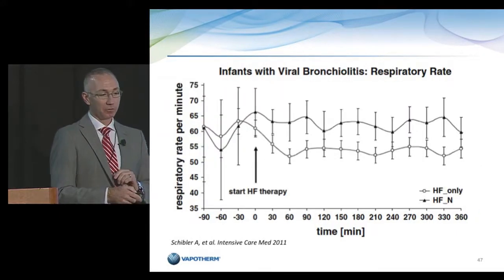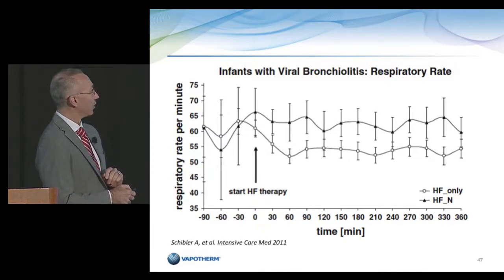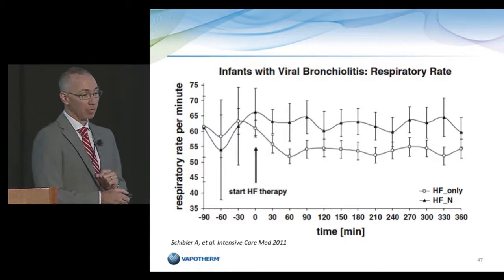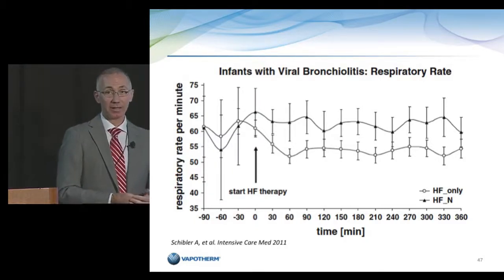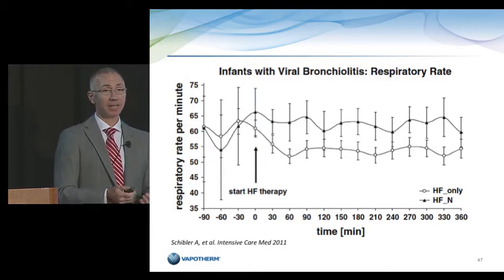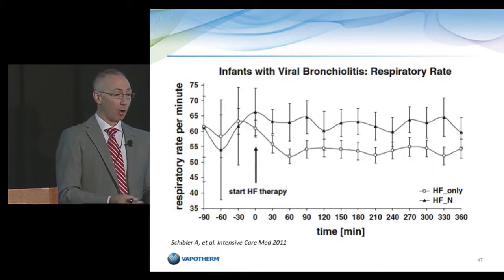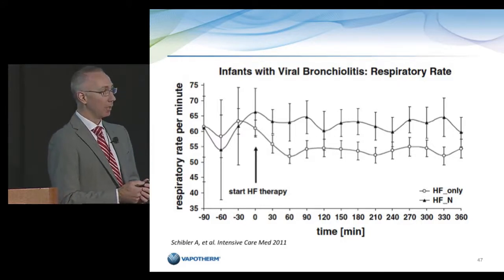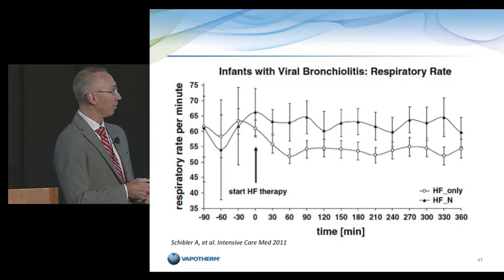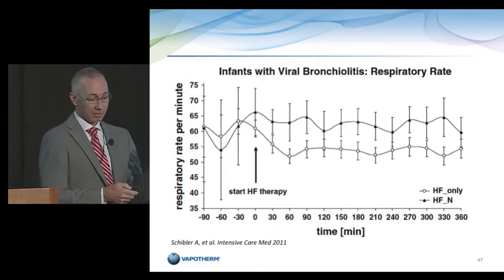The same is true for respiratory rate. So by 30 minutes after initiation of high flow therapy, you already see a separation between the groups. And by 60 minutes, responders have already declared themselves. And we see that daily in clinical practice. Patients become almost immediately comfortable if they're going to be responsive. Some patients are just too exhausted and they are beyond the point of benefiting from this technology by the time they get to us. And some patients just have progression of disease and require escalation of support.